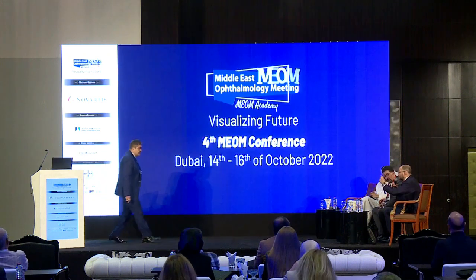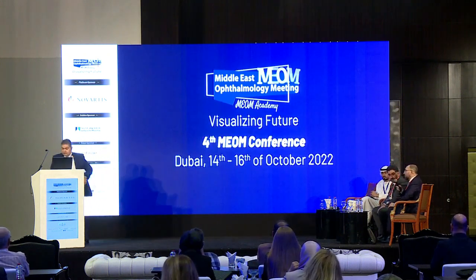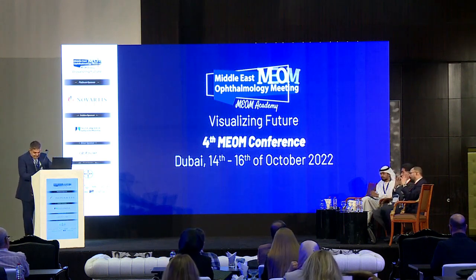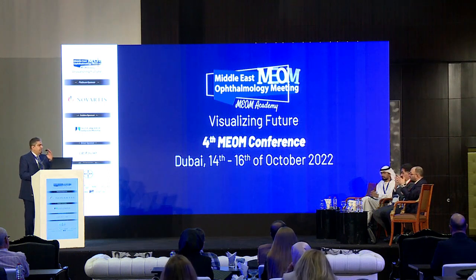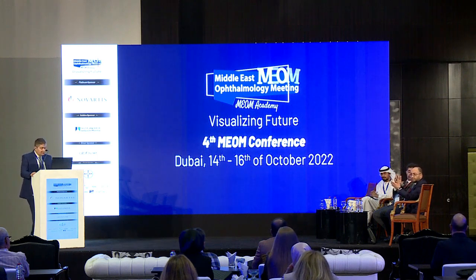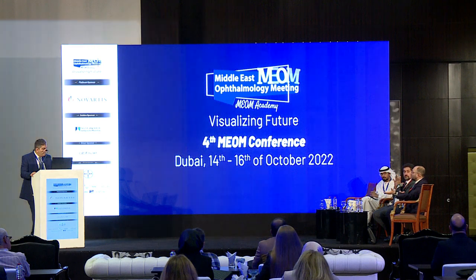Great, thanks, Dr. Ahmed. Just one comment, please, if you don't mind. What's the percentage of variable figures coming from CBI? When you compare the Corvis to the Belin-Ambrosio, the audience needs to know that the Corvis is a machine depending, as you said, on the biomechanics of the cornea, and it is connected to the Pentacam. So it depends on the topography of the Pentacam. For BAD, the Belin-Ambrosio, it comes from the Pentacam. But for the CBI and TBI, the Corvis is doing it.